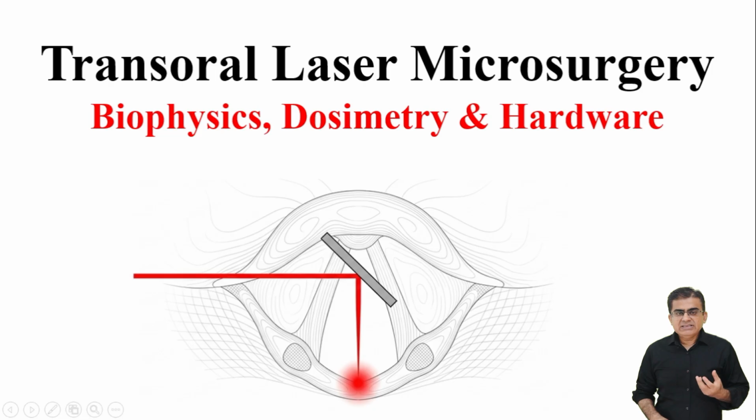When you hold a normal steel knife, you can actually feel the tissue as you cut. But a laser gives you absolutely zero physical feeling. Your surgical precision, your safe cancer margins, and your patient's life depend entirely on your scientific knowledge.